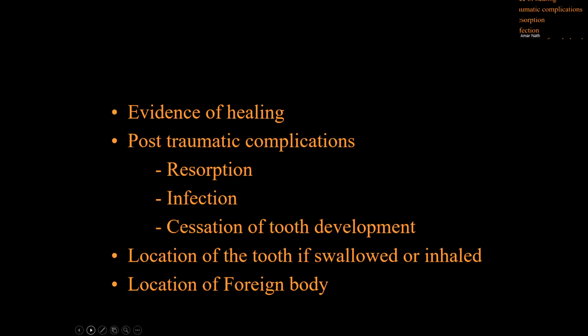The other diagnostic information is the evidence of healing, whether the fracture is healing or not.